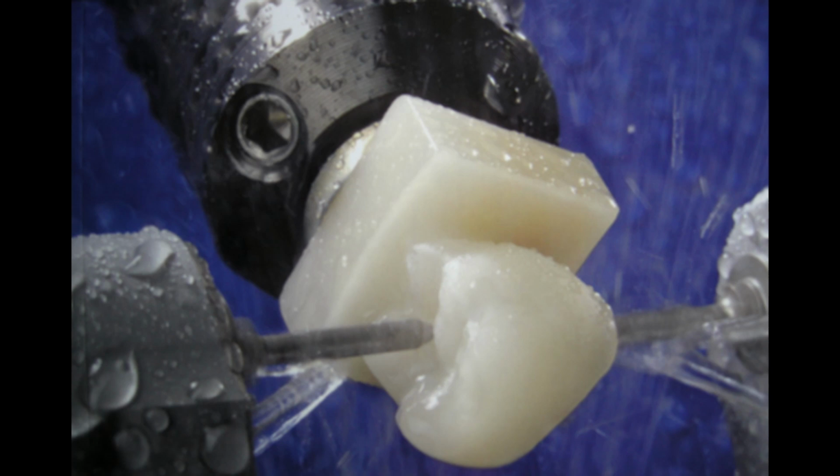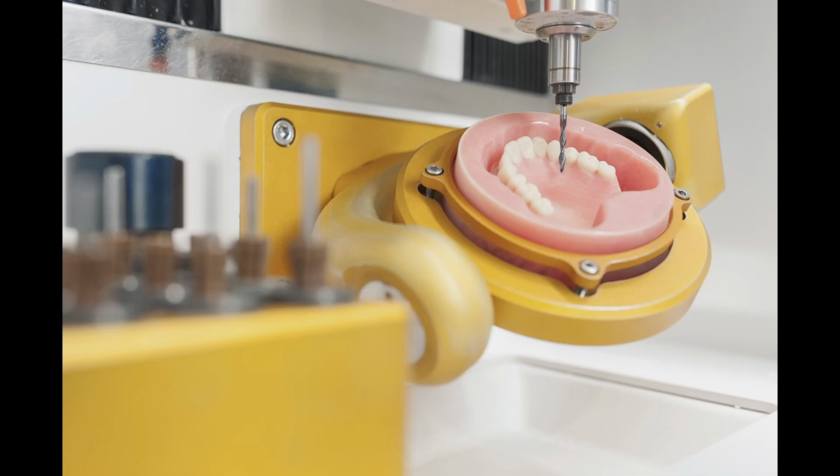Labs are able to use a combination of printing and milling to create a whole variety of dental prosthetics. This ranges from a single crown or an onlay, all the way to a complete denture as well.